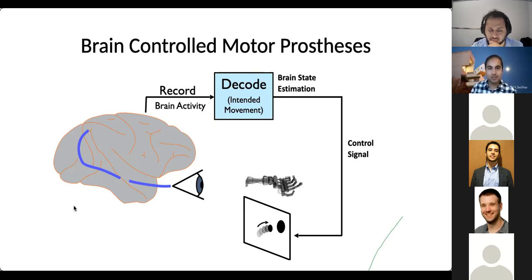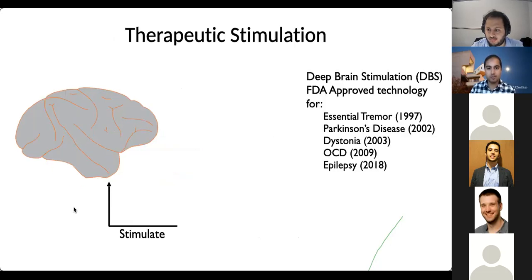And so in these systems, you might primarily be thinking about motor prostheses as controlling something like a computer mouse or a natural robotic limb. But more recently, there's been a lot of attention and new demonstrations of what folks are calling speech prostheses. And these speech prostheses, the way they're being designed at present, many of them, are still fundamentally motor prostheses. And I'll talk about that a little bit later today.